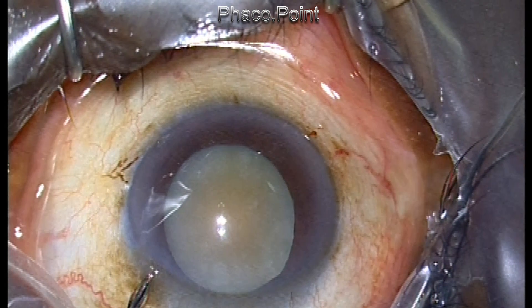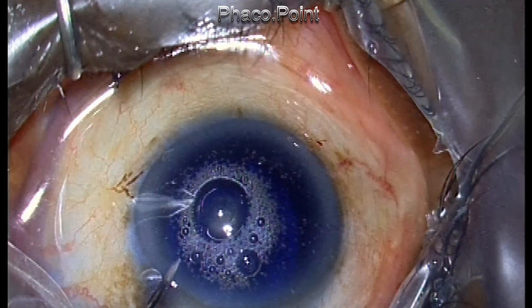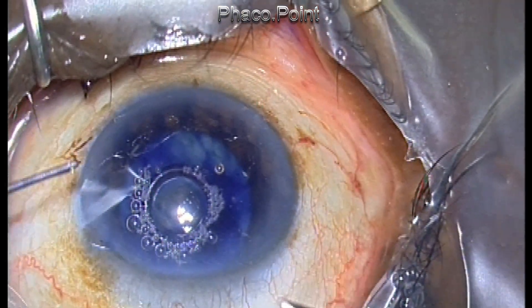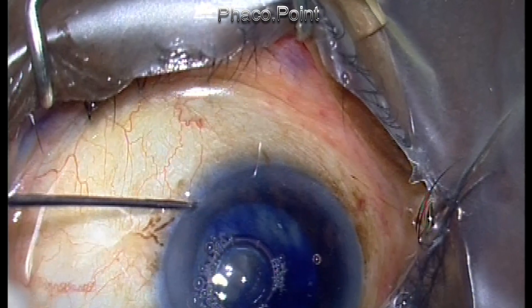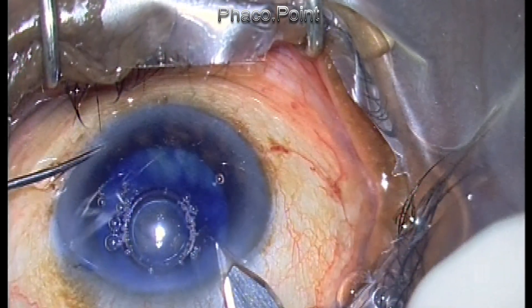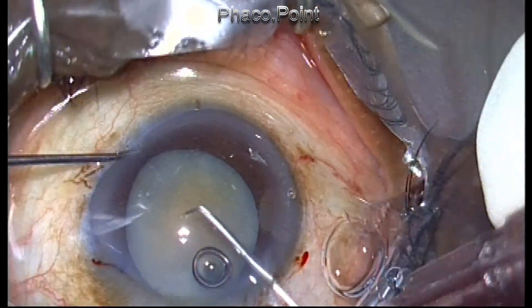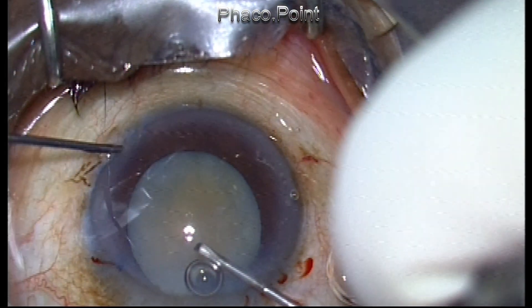This cataract is a white mature cataract, however it is not intumescent. The surgery is being performed under topical anesthesia. It is called a chalky cataract because the anterior capsule has shriveled, the anterior chamber depth is maintained, and the lens is not intumescent.